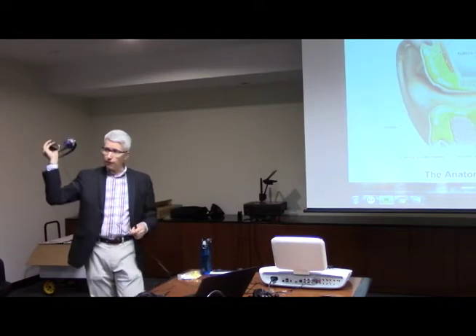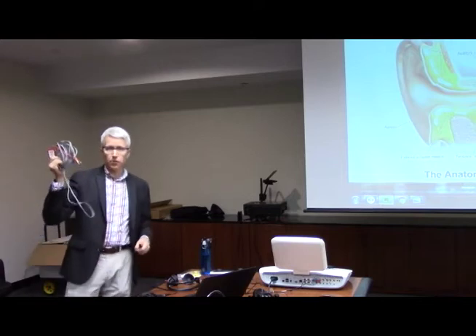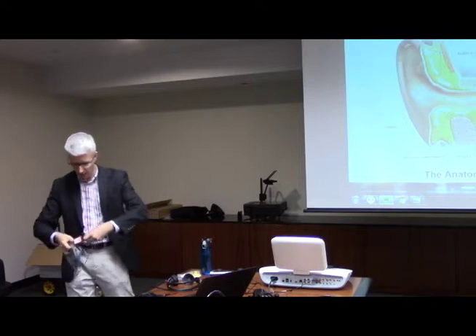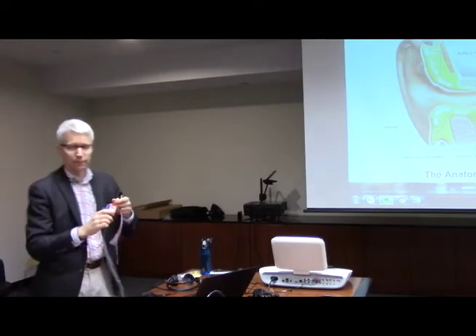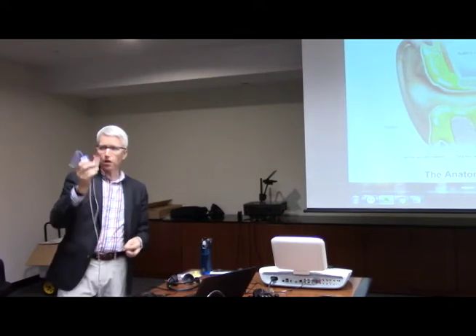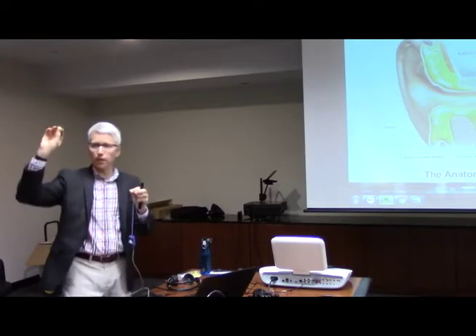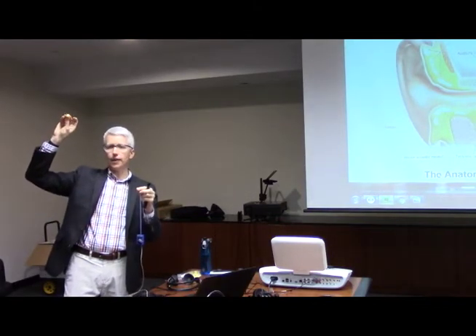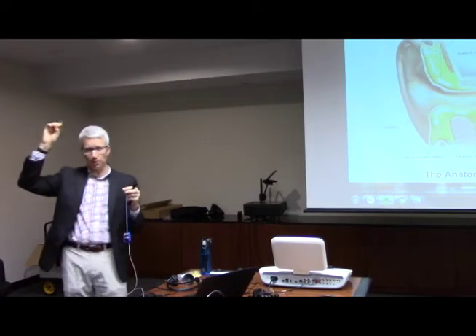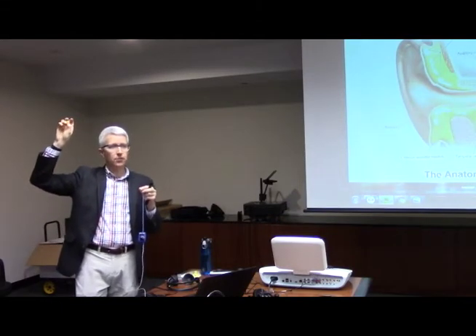So, like I said, we've got headphones to do that with. We also have insert phones. These are the two common ways that we introduce sound into the ear. Again, you'll notice consistent red and blue. These would be clipped on here, and then they've got a little tip that you would put these insert ear tips on. Anybody who's been in the back has seen bags upon bags upon bags of these. We sell these in supplies, but these are the insert ear tips.